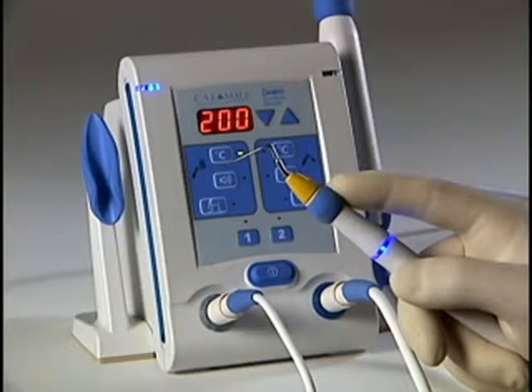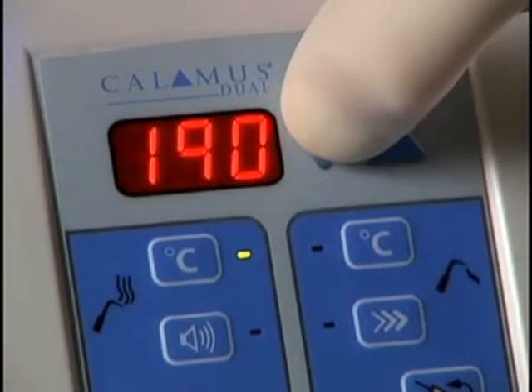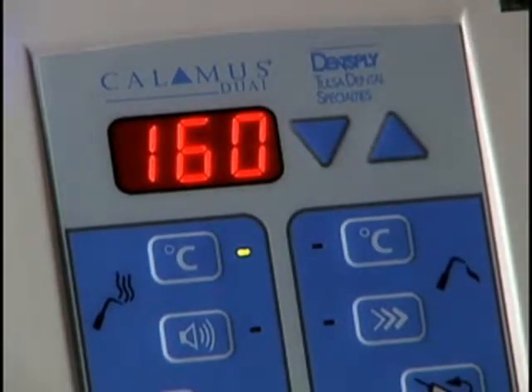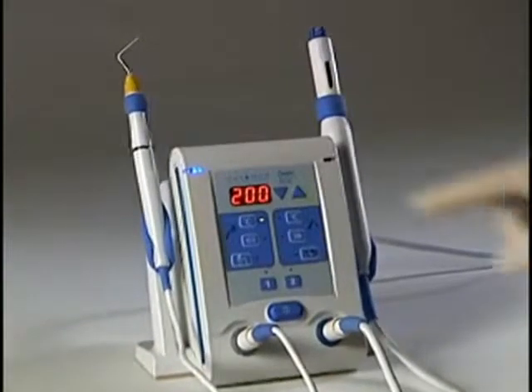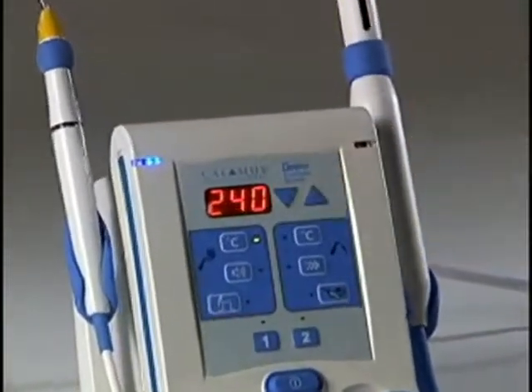When pressing the activation cuff, the tip will heat for 15 seconds for temperature settings of 200 degrees C or lower. The tip will heat for 10 seconds for settings above 200 degrees C before timing out.